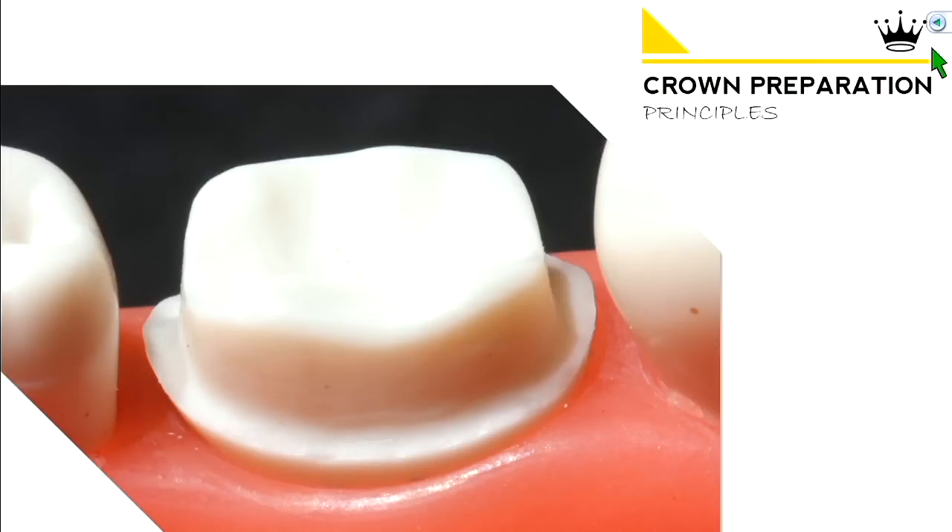Today we're going to go over crown preparation principles. How do we grind this tooth down? What are we looking at in terms of parameters, and what's the sequence in which we should do this?